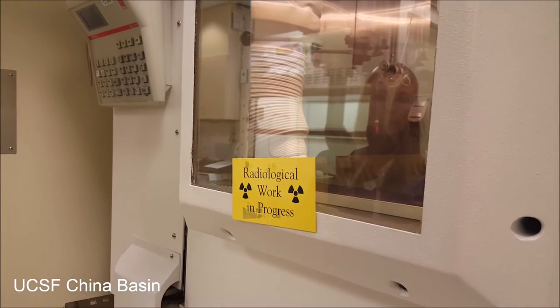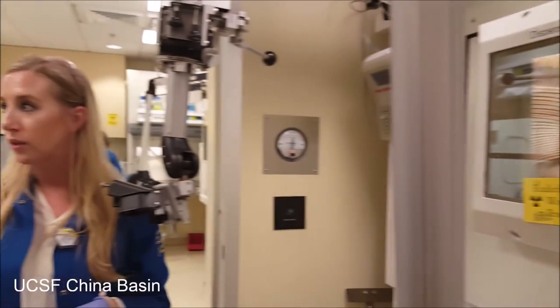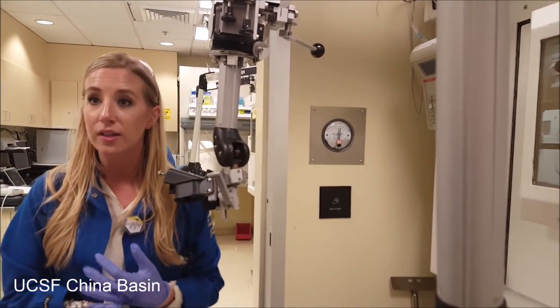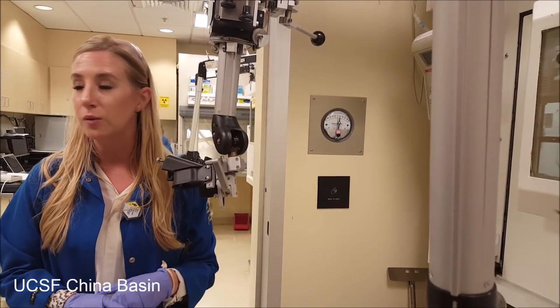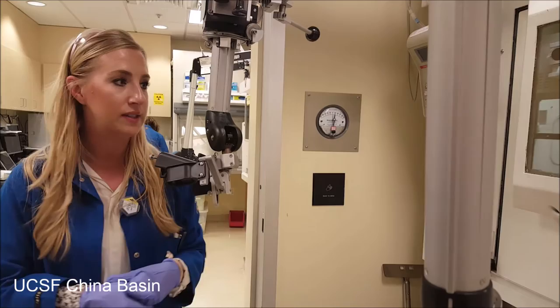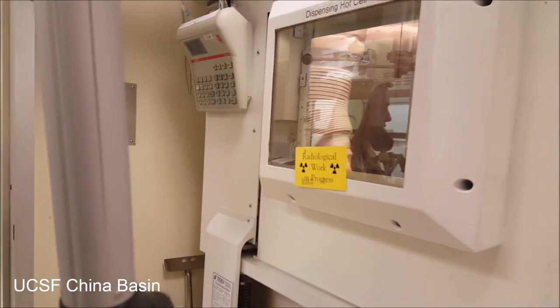We'll drop that in there to see how much activity we made, then we'll bring it back up and draw a QC sample out of that. That's what we'll do all of our quality control tests with — we have to make sure that it's good to go for humans before we let it go out of the facility. Then the rest of it we send upstairs for patient doses.